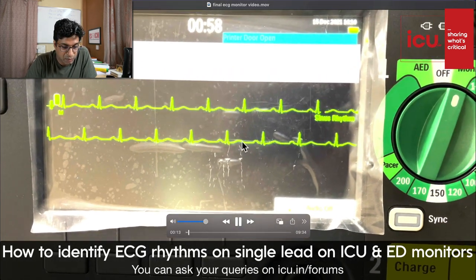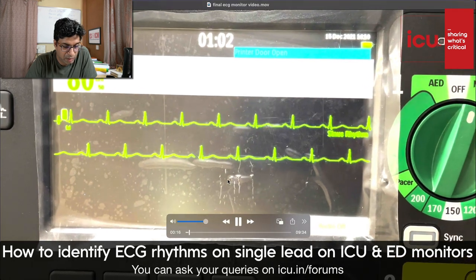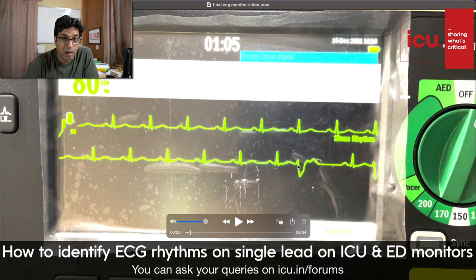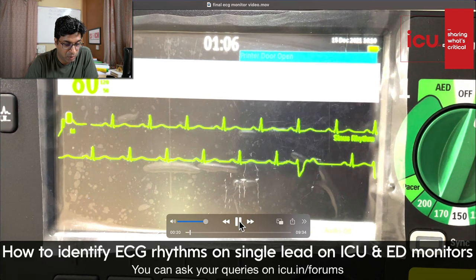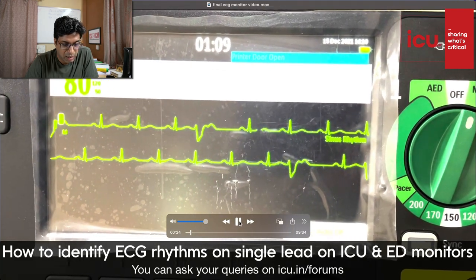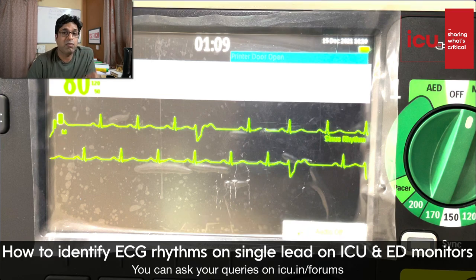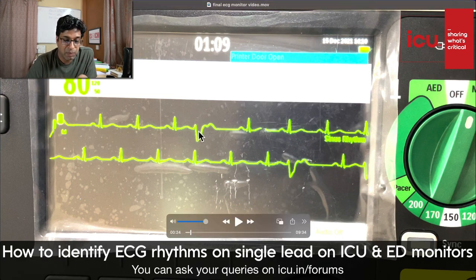Now let's see. Watch carefully. This came up. So a broad QRS complex came up. Let's see how it is coming. There is an occasional broad QRS coming in between the sinus rhythm. So it will be called unifocal premature ventricular contraction, so PVCs. It is coming prematurely. The P wave should come here, and before the next P wave, this prematurely came up from the ventricle. So it is called premature ventricular complex or contraction.